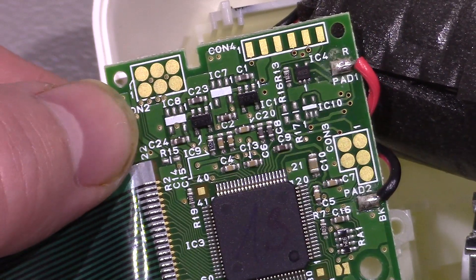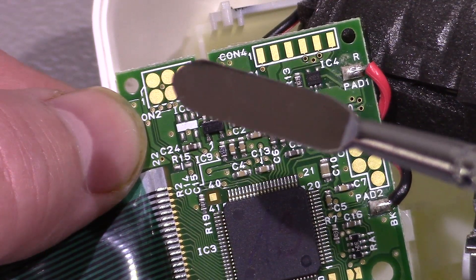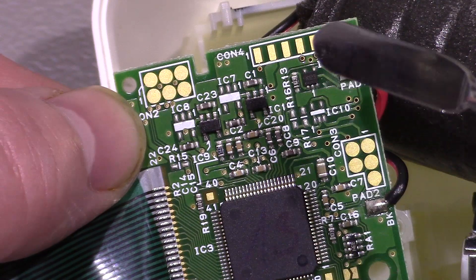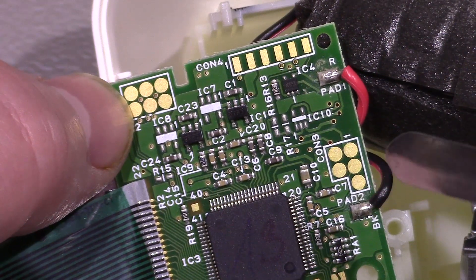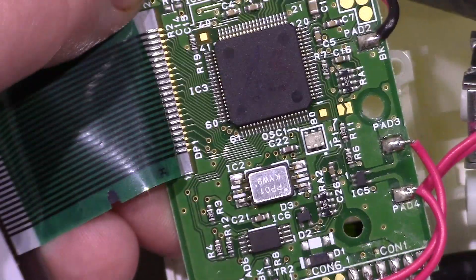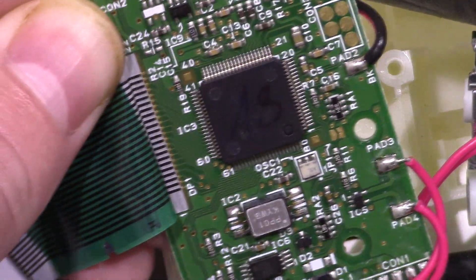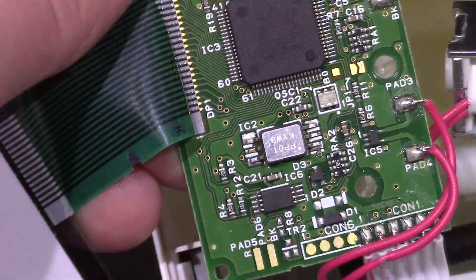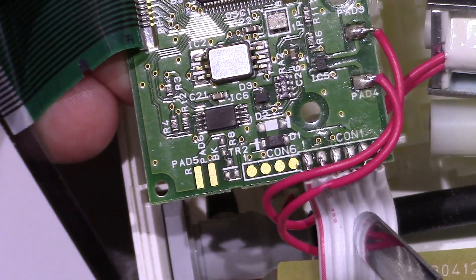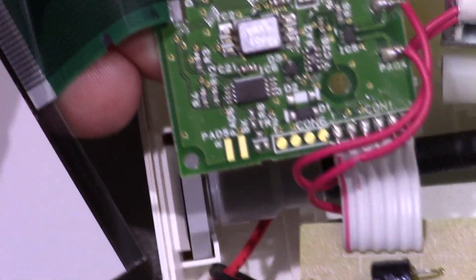Here's a closer look at the board. You can see there are lots of spare spaces because with these you can get various models that do different things. There are some test pads over there, and another connection - CON4. There might be more test pads because you've got CON2 and CON4 there. There's a chip there but I don't think we can get anything off that - it's scribbled 'A3' and I think they may have actually ground the marking down to prevent people seeing what they're using. Further down we've got the ribbon cable going off CON1, which goes down to the board with our switch. And there is a capacitor there - 10V, I guess that's 100 microfarad - and a spare one there.